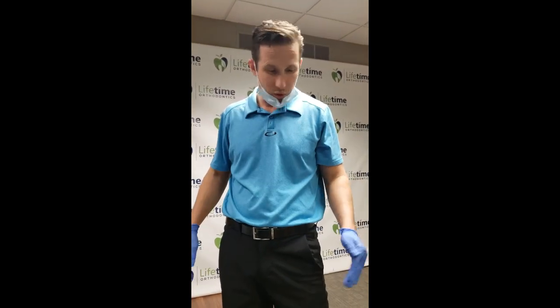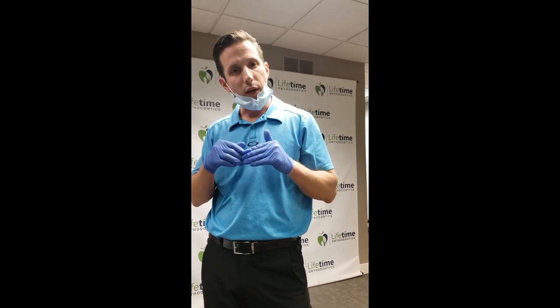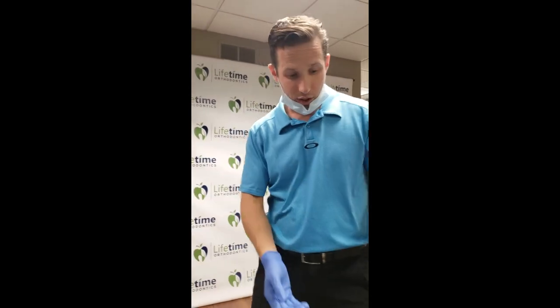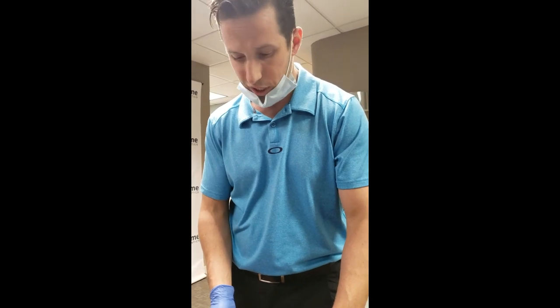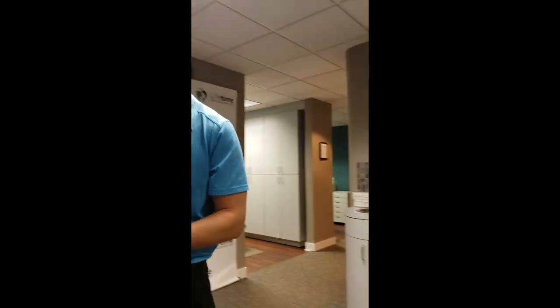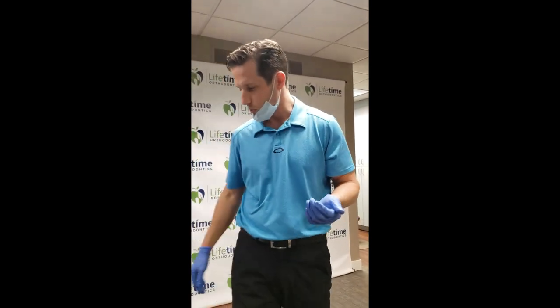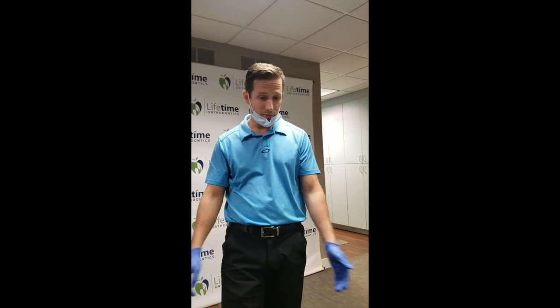Once you get used to the force ones and do a good job with them, we'll move you up to force twos, which are eight ounces. For someone like this patient who has a history of jaw joint issues, you need to let me know if your jaw joint starts giving you problems - then we might have to take a timeout with the elastics or stay on the force ones. Those are the other things we want to talk about with our patients. I think that covers everything.